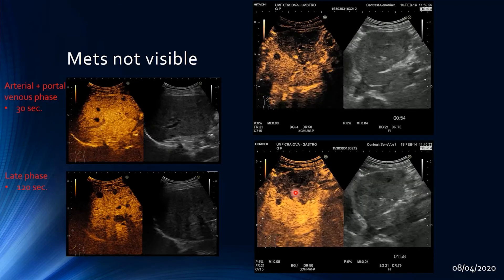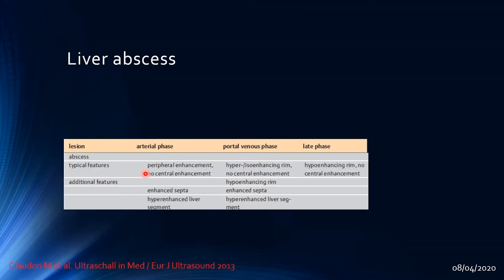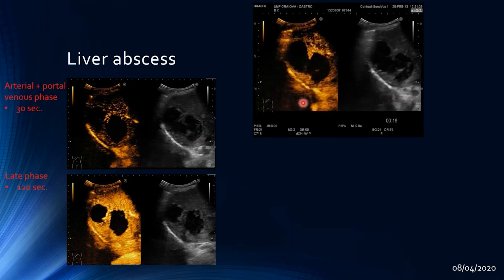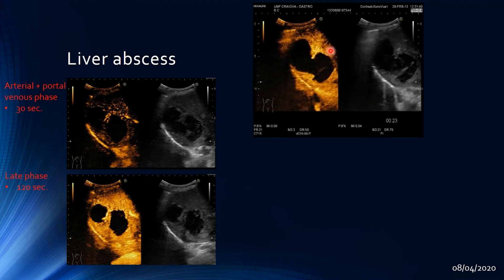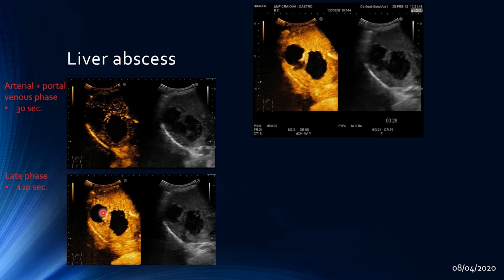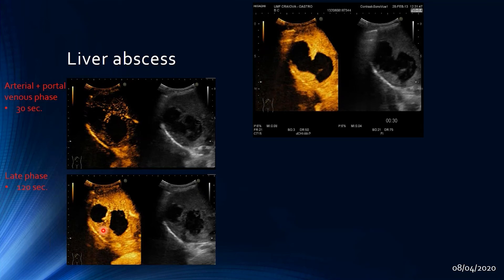Liver abscesses must be differentiated from metastases. Abscesses show peripheral enhancement in the arterial phase with no central enhancement, sometimes with enhanced septations. In the portal and venous phase the rim remains hyper-enhanced, and in the late phase the rim can still be hyper-enhanced without central enhancement — so there is no specific washout seen with liver metastases. A clear example shows enhanced septations and peripheral rim persisting into the late phase.